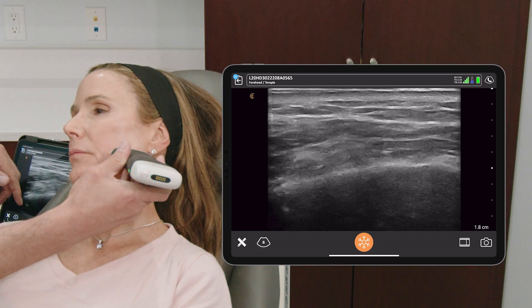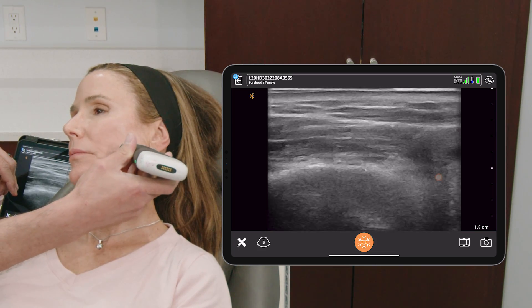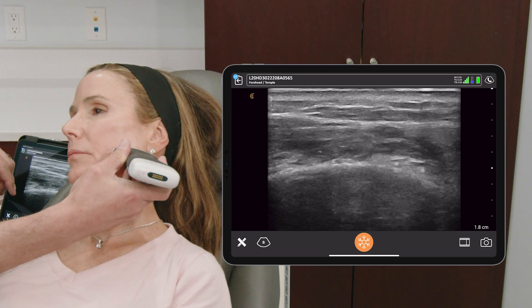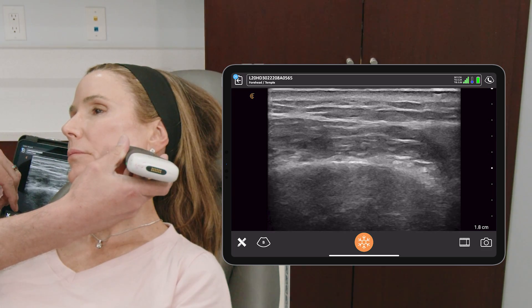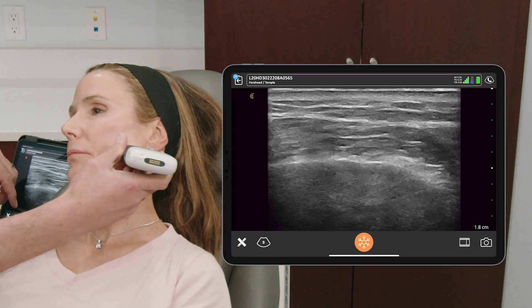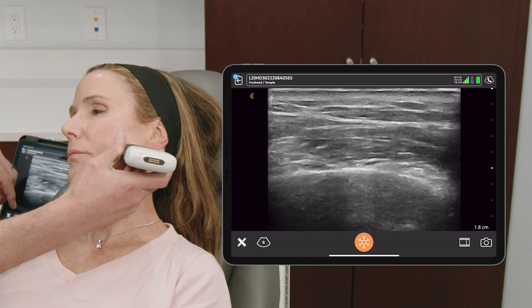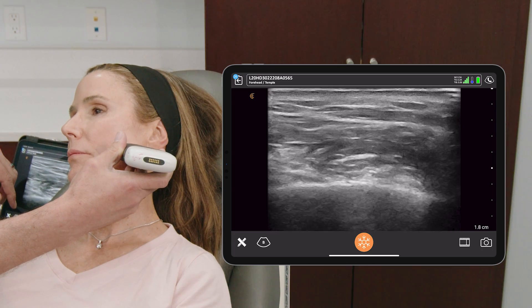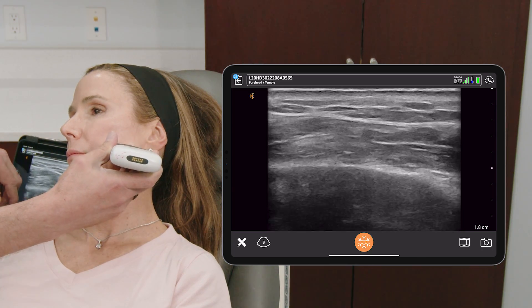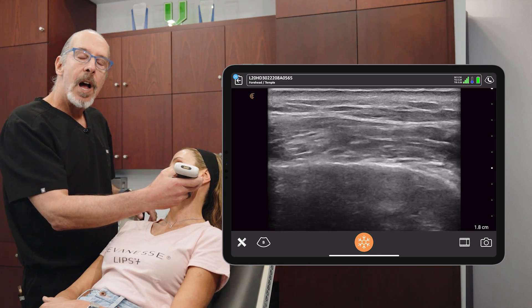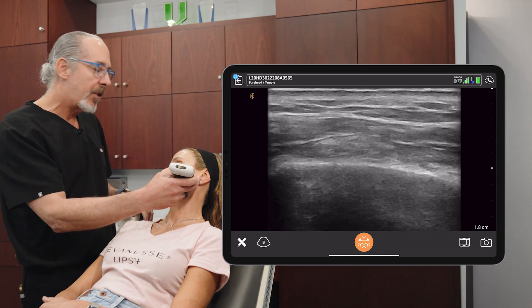At the very bottom of the screen you're going to see the mandible. It's the hyperechoic area. Bone is going to be very white because the sound bounces off of it very well. Now I want you to clench your teeth — you see the masseter clench and relax — and that's a really good way to get oriented: ask the person to use the muscles in the area you're examining.